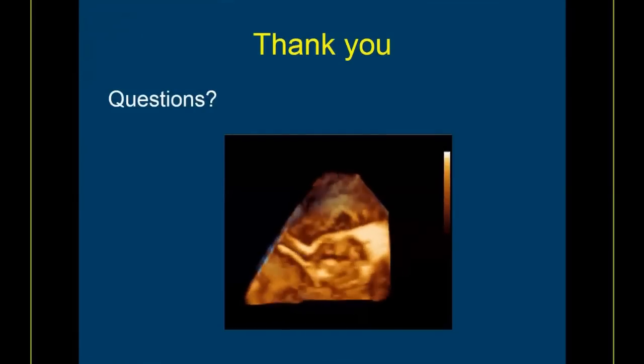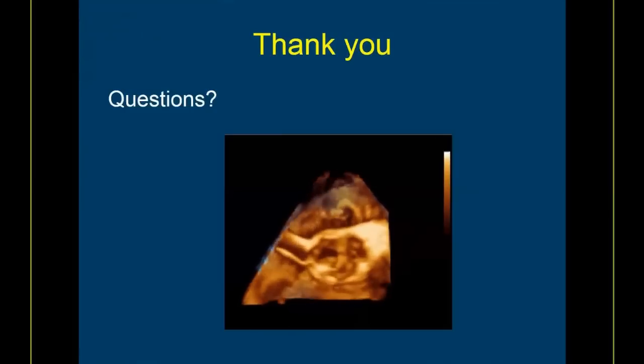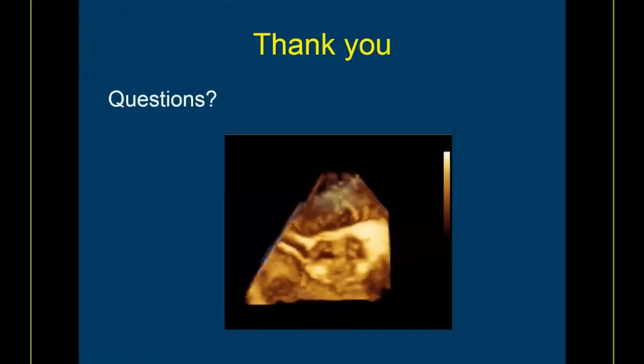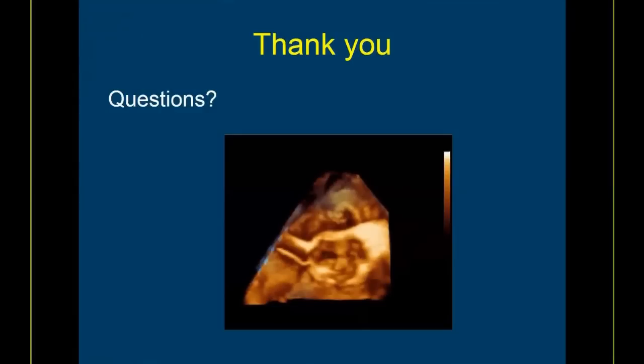The first question is, in which conditions do we need to assess severity of aortic stenosis by catheterization? Good question. With the onset of Doppler echocardiography, I would say over 90% of the cases of severe aortic stenosis are now assessed by echocardiography. The cases in which you need to corroborate with catheterization are when you have discrepant echocardiographic data with discrepant clinical data.